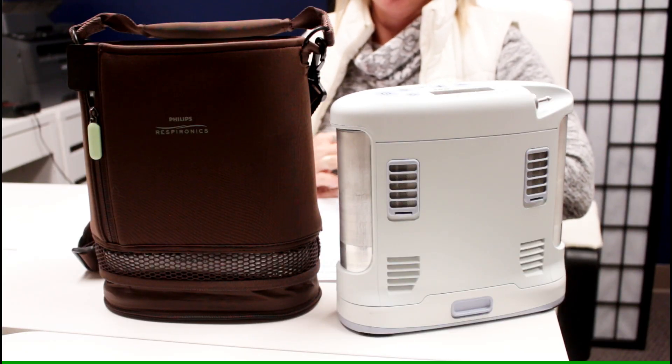What is the oxygen purity level? Most concentrators deliver between 87 and 93 percent pure oxygen.